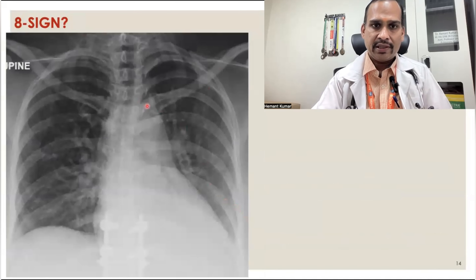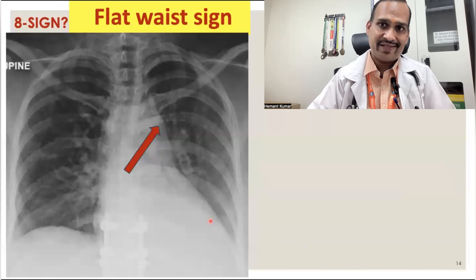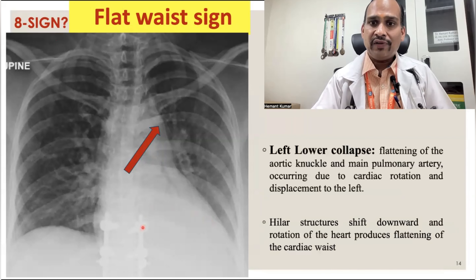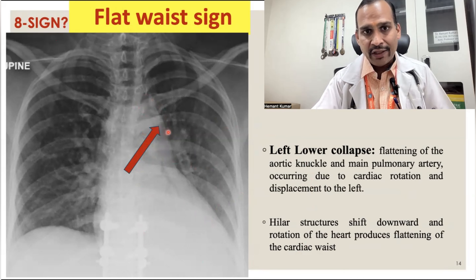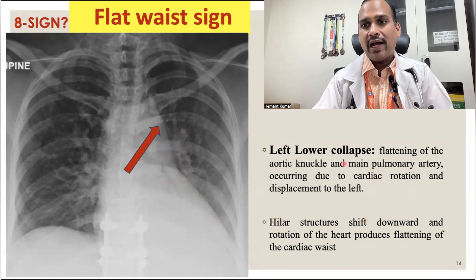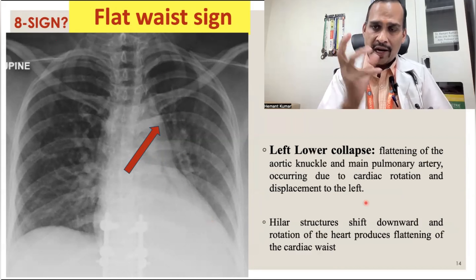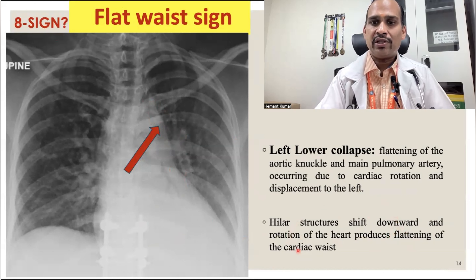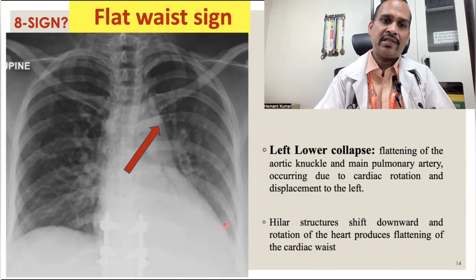Sign 8 is the flat waist sign, occurring in left lower lobe collapse. Because of left lower lobe collapse, there is flattening of the aortic knuckle — we cannot make out the aortic knuckle or the pulmonary artery. There is loss of contour of the aortic arch and pulmonary artery due to rotation of the heart. The hilar structure shifts downward, and rotation of the heart produces flattening of the cardiac waist — this is the flat waist sign.